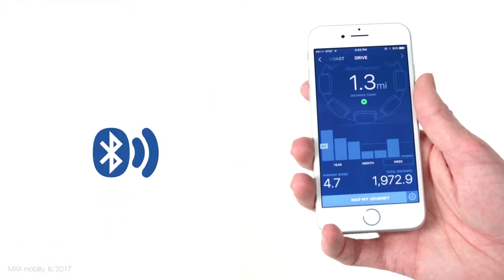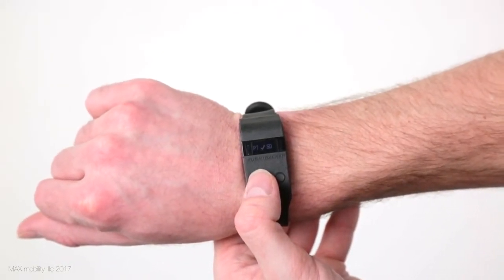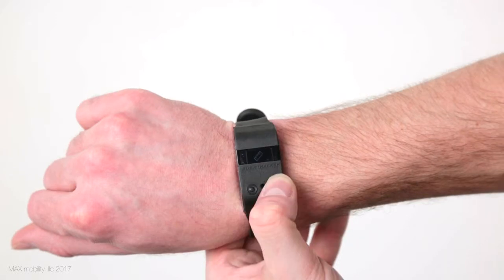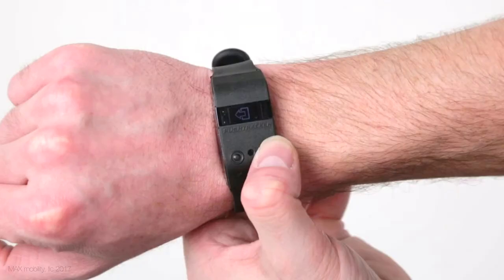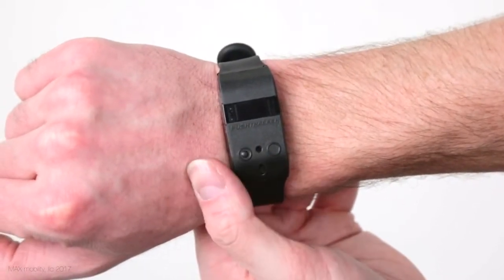You'll want to make sure Bluetooth is on and the app is pulled up on your device when doing this. If you need to repair or pair a new PushTracker to your SmartDrive, make sure no other SmartDrives are switched on in the vicinity and go to this PT Bluetooth SD pairing screen. Select the unit screen to set either miles or kilometers for the applicable metrics. Finally, use the exit icon or wait for it to automatically time out to leave the settings menu.